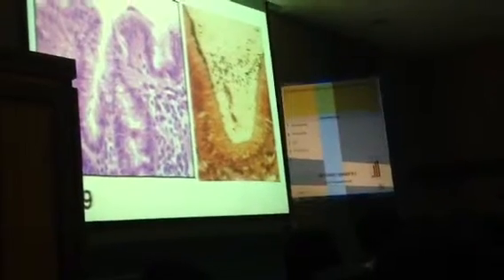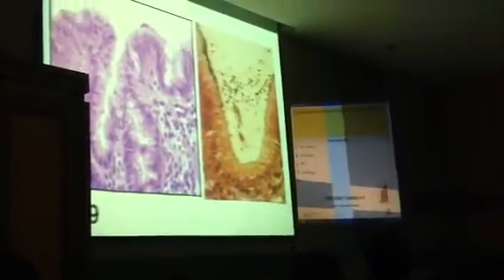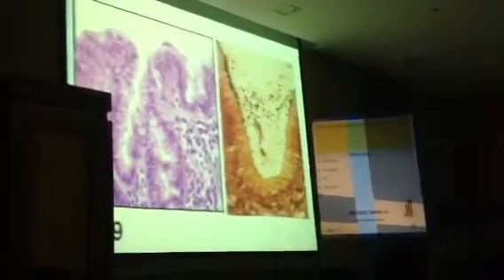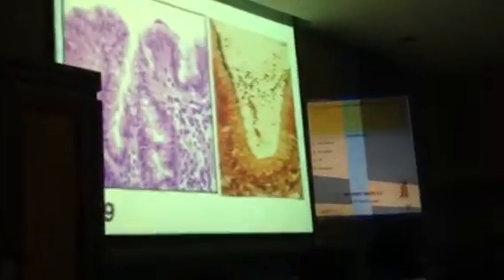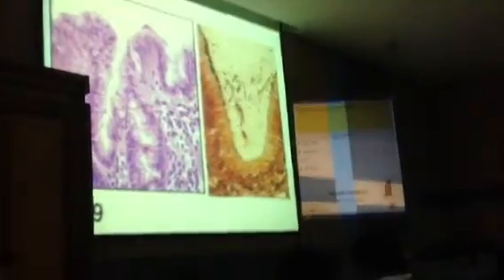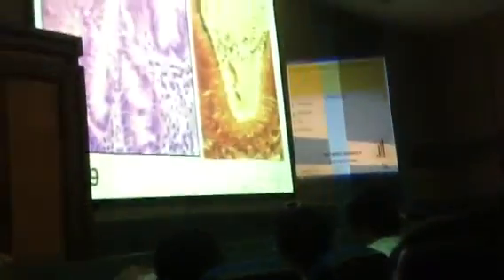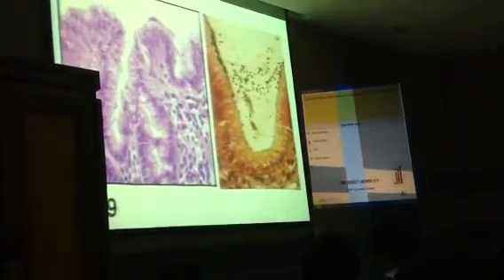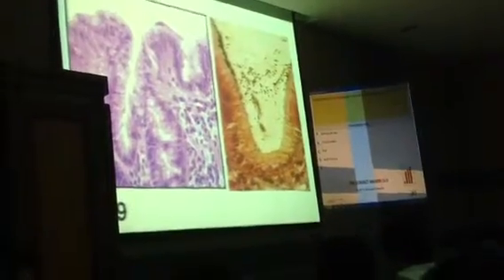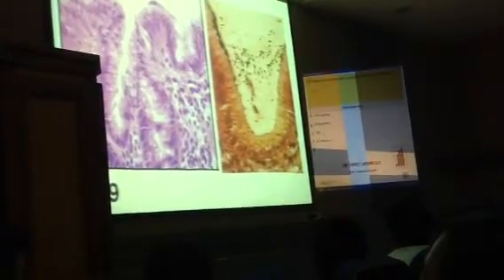Wow, that is a slide. Depicting what? H. pylori. H. pylori type of gastritis. So H. pylori type of gastritis is one of the types of chronic gastritis, which is A, B, C. A for autoimmune, B for bacterial, the H. pylori is a bacteria, and C for chemical. Now, H. pylori is associated in the pathogenesis of lymphoma, of chronic gastritis, the B type of gastritis, also peptic ulcer disease. So all of the above are correct.